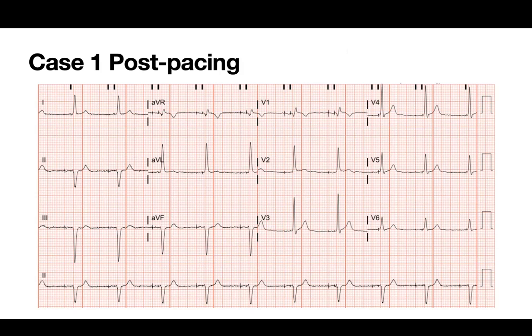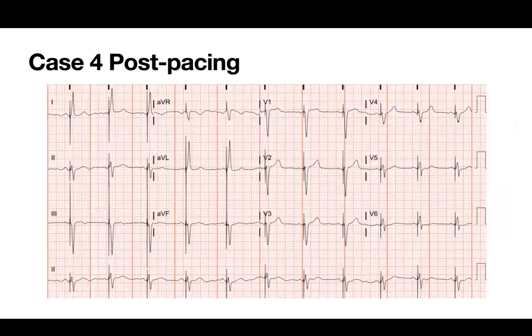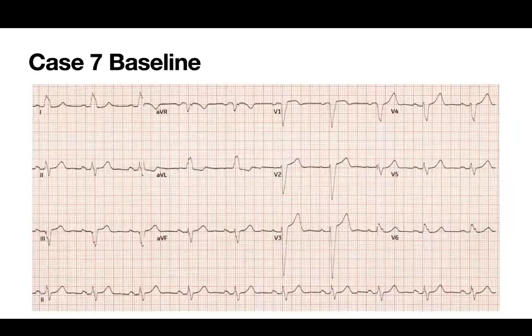Do you slit the sheath? When do you slit the sheath in those cases? Yeah, I slit it, same thing. I slit the sheath because you never know what's going to happen when you're slitting. I secure the lead, make sure everything is all good, and once I know that's there, then I pull back the atrial lead to the atrium and position it. Some people say do it the other way, but I think that's probably the safest.